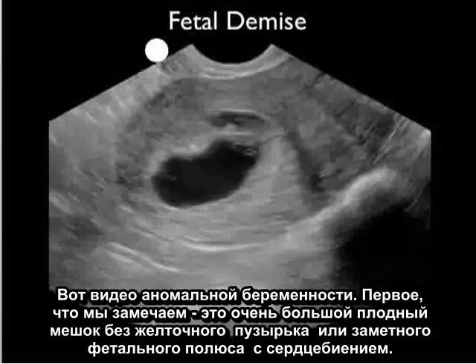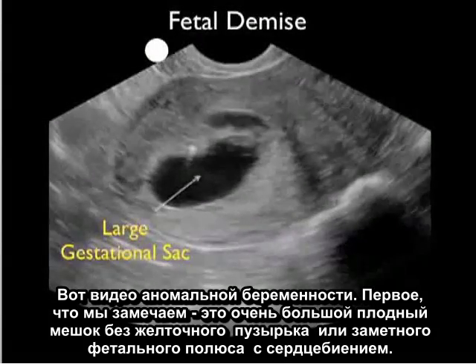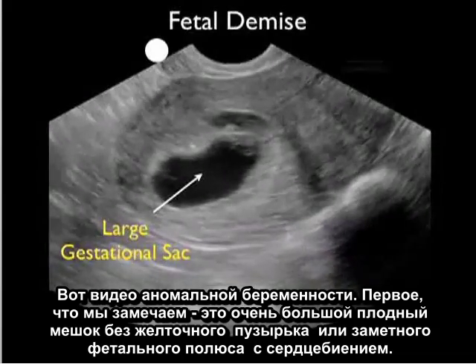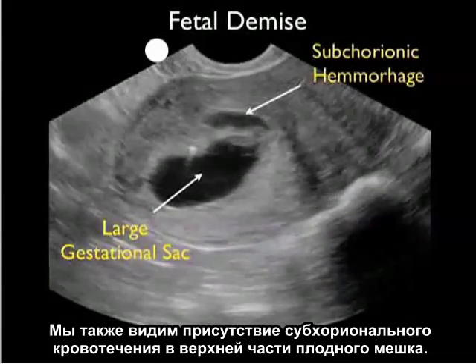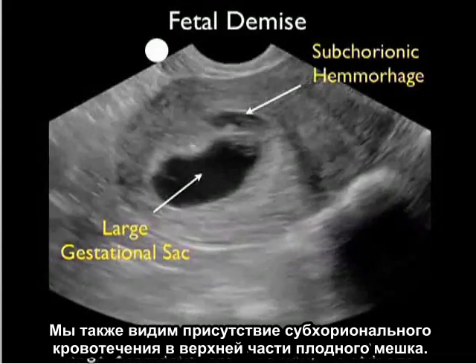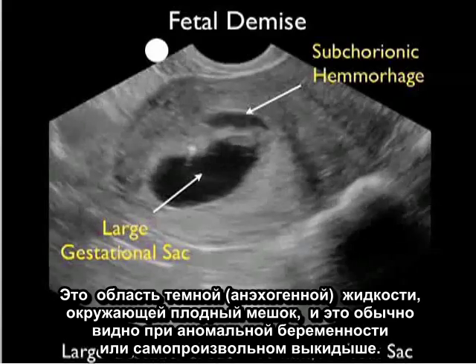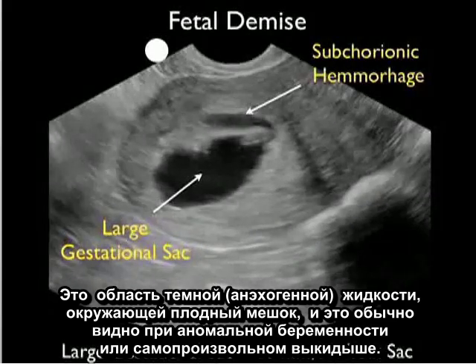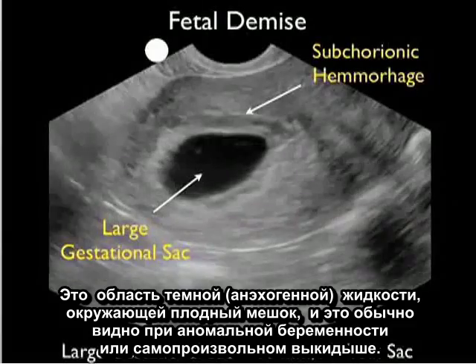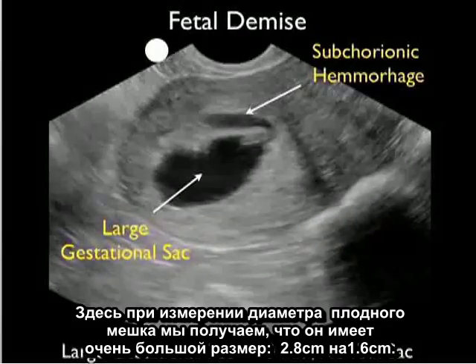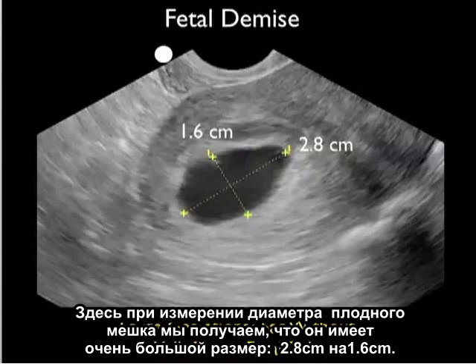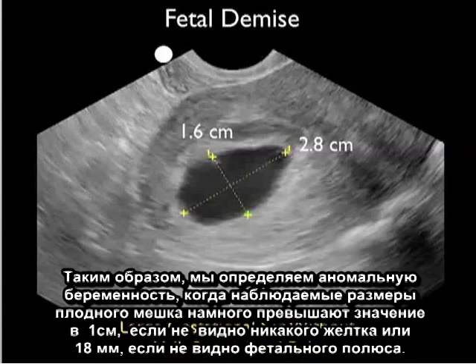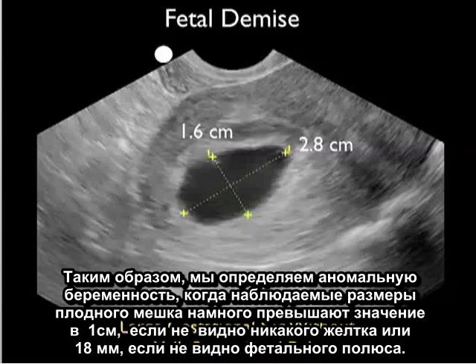Here's video from an abnormal pregnancy. The first thing we notice is a very large gestational sac without a yolk sac or discernible fetal pole with heartbeat. We also see the presence of subchorionic hemorrhage to the superior aspect of the gestational sac — that area of dark or anechoic fluid surrounding the gestational sac — seen commonly with abnormal pregnancies or spontaneous miscarriage. Placing the calipers, the gestational sac measures very large at 2.8 centimeters by 1.6 centimeters, much larger than the 10-millimeter or 18-millimeter thresholds.